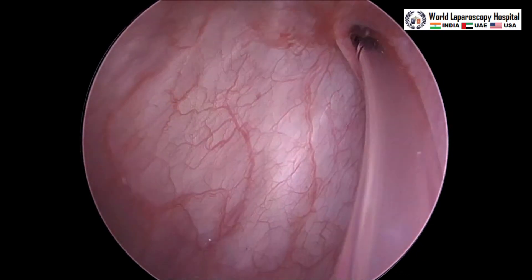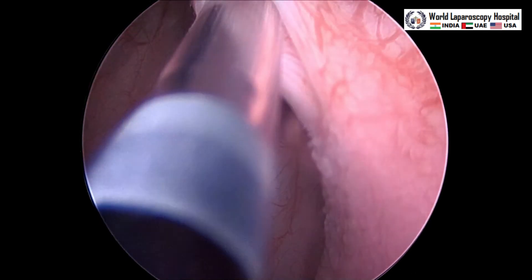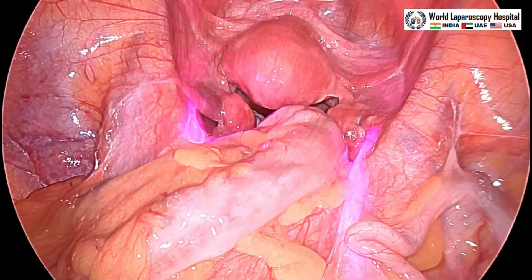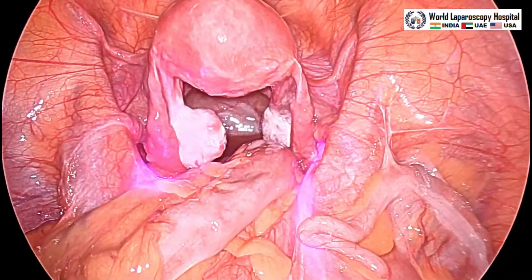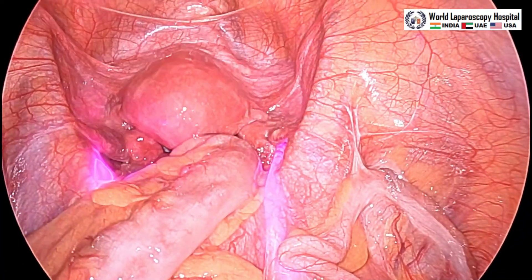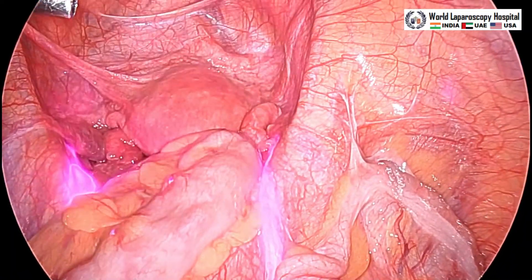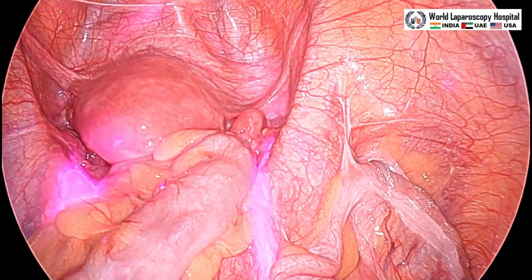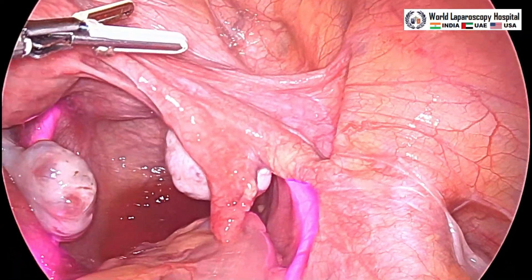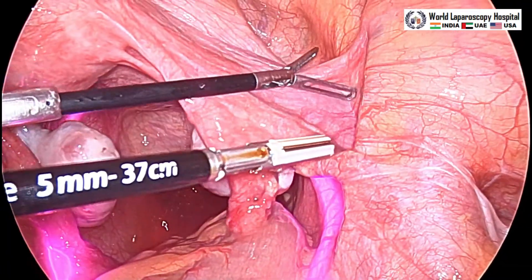To confirm 15 centimeters, you should see three thick markings and visualize that. Now cystoscopy is complete and we can see the entire ureter is illuminated. That way you can almost eliminate the risk of ureteric injury during total laparoscopic hysterectomy. Cystoscopy is very important to learn for the gynecologist — it is a very easy procedure and everyone should be well versed to perform it. Thank you very much for watching.